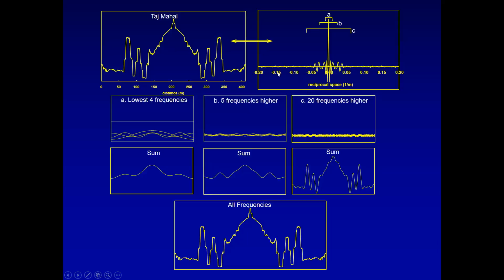Now, the image, this may be a strange idea also, we acquire the image in time. You open the receiver and we see these things happening while we're applying a gradient, as I'll explain later. So you could draw a time axis on here and put seconds or milliseconds as the units.